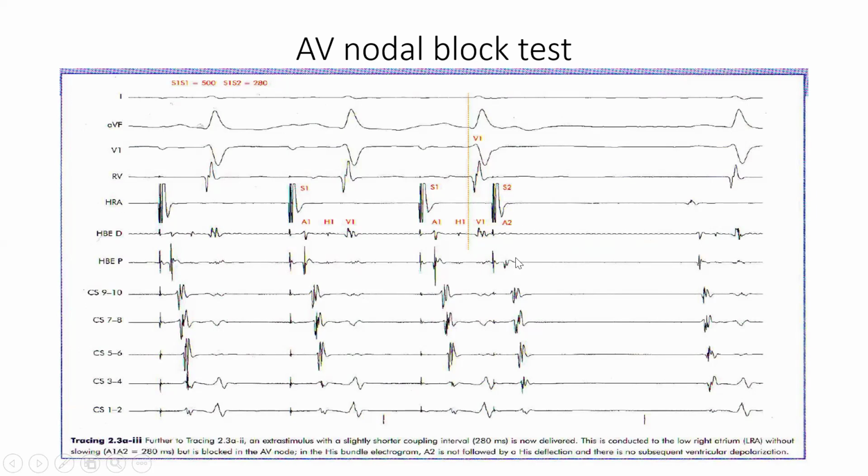Sinus arrest. Don't worry, it's not hard, it's straightforward. I know you are getting it, but it's inside you and you just want to bring it out. So that's an A, right? Yes, this is an A. They labeled it, meaning that it is a sinus arrest or something. Will you have a sinus arrest if you have atrial activity? Atrial activity. Okay, an A.